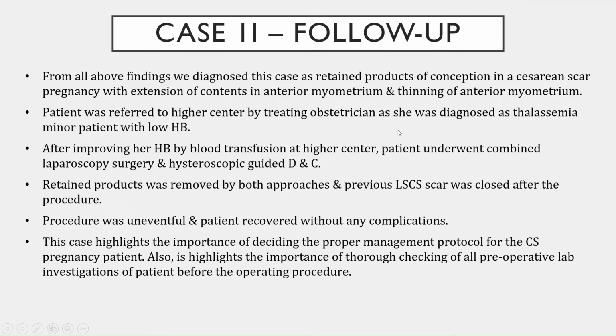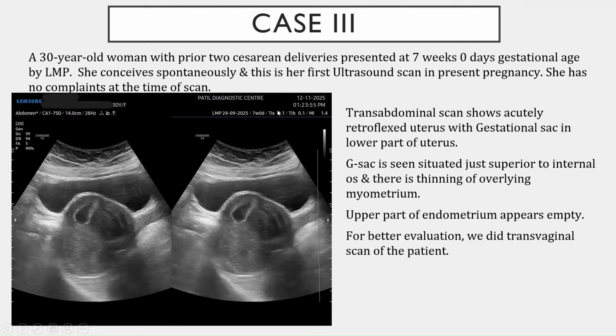At the higher center, she was operated on under combined laparoscopic and hysteroscopic guidance, and the patient was operated on successfully and she recovered. So this case highlights the importance of deciding the proper management protocol for caesarean scar pregnancy patients. Now let's go to case 3.